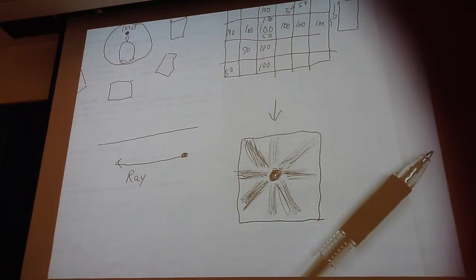And I think on... What's that? The raw data and the gated and ungated. Well, this is just raw data. What's the purpose of gating? To reject certain beats.